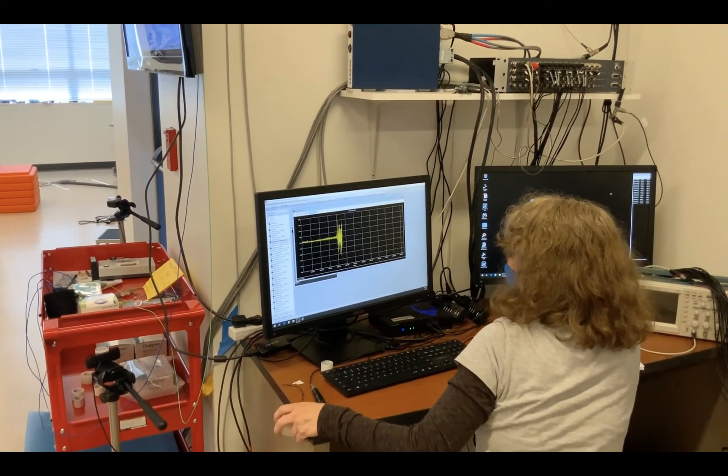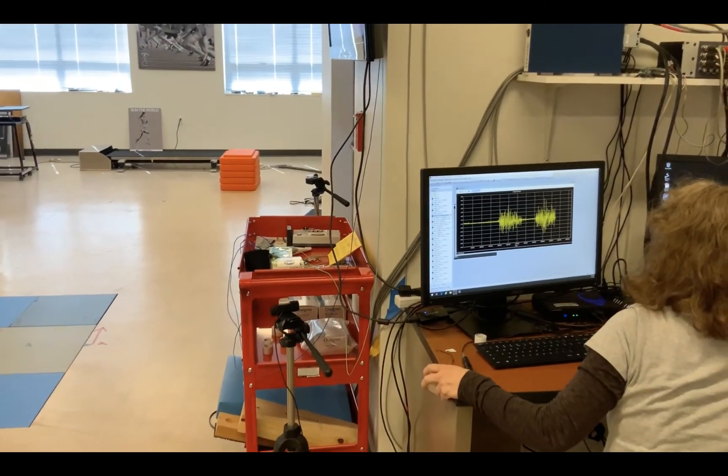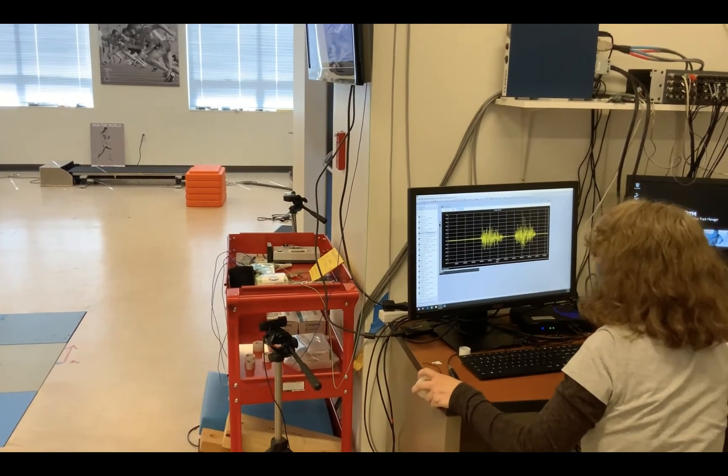Then you can go ahead and have the subject again toe flex to make sure that you're getting a good signal on that sensor.